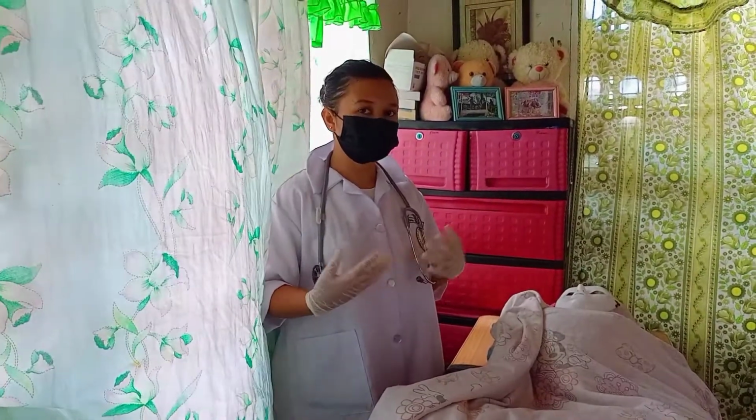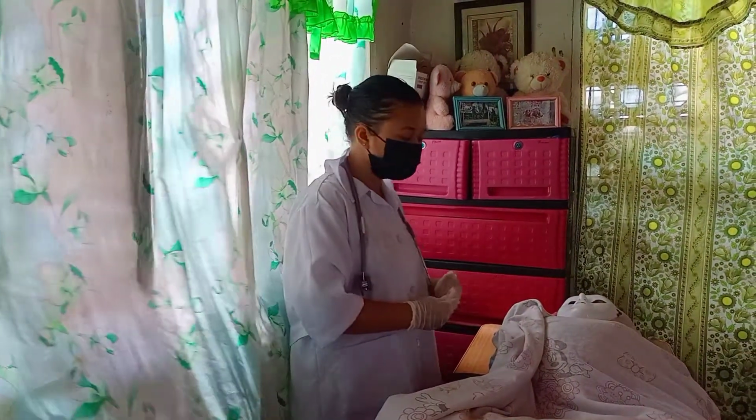Dispose of equipment used to prevent transmitting microorganisms.